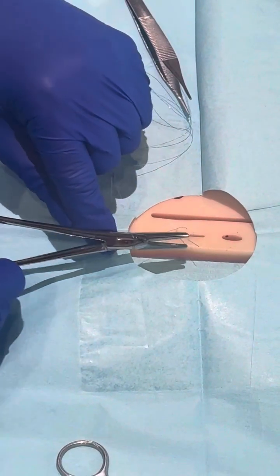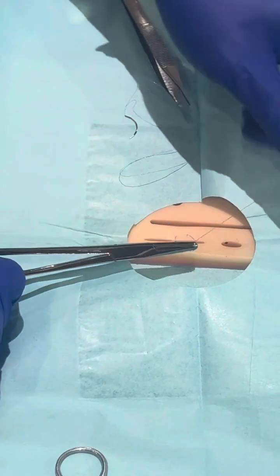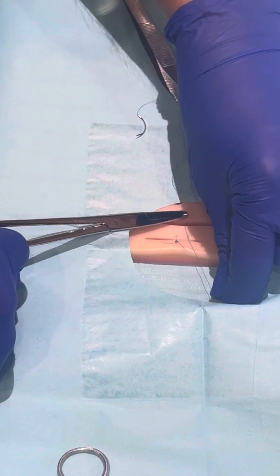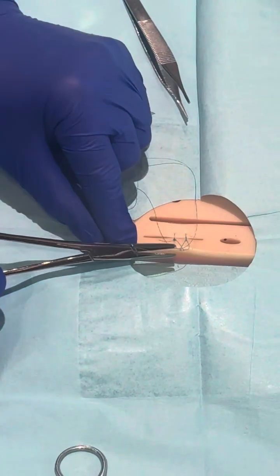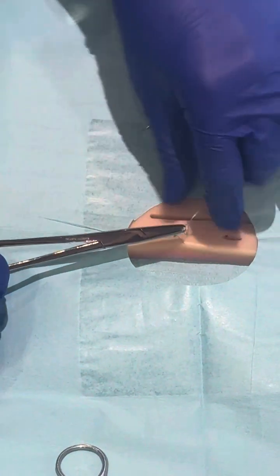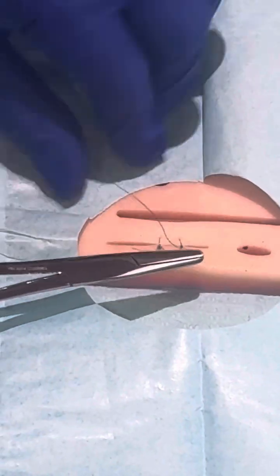My needle driver is not holding the suture properly.